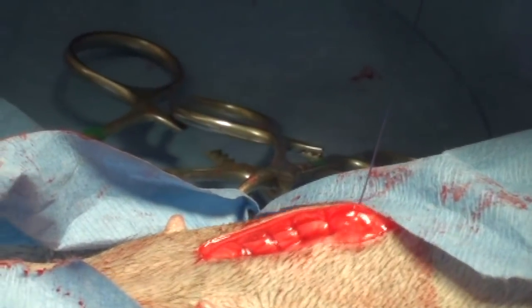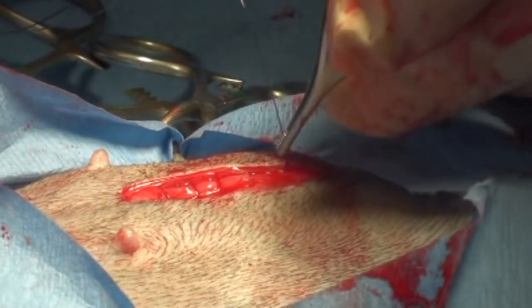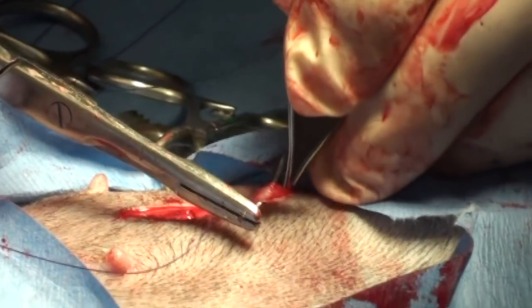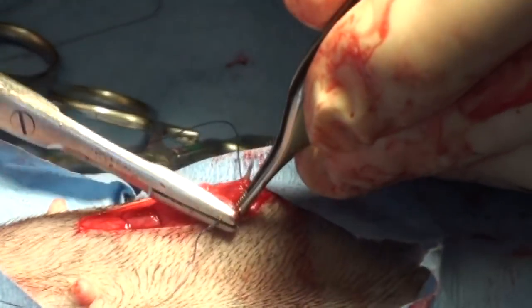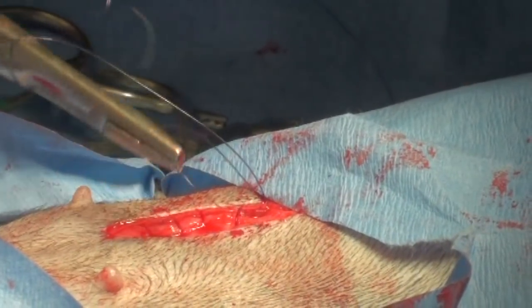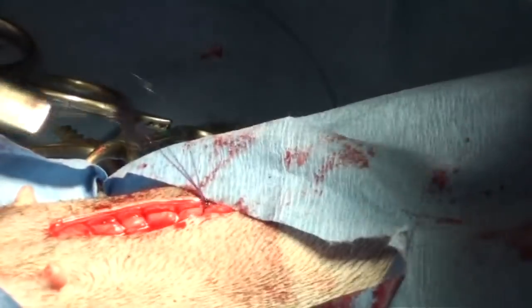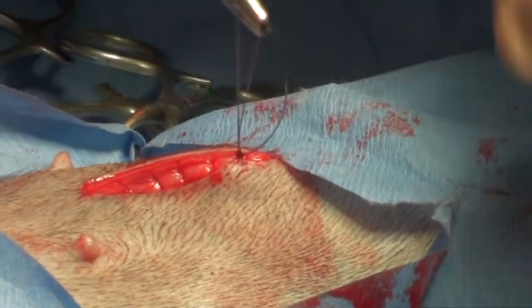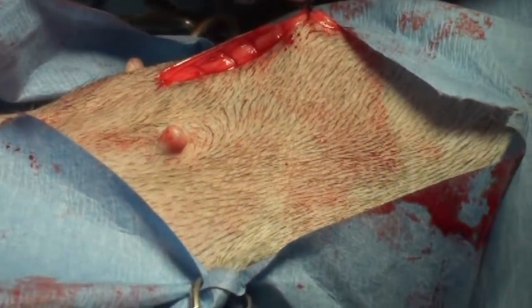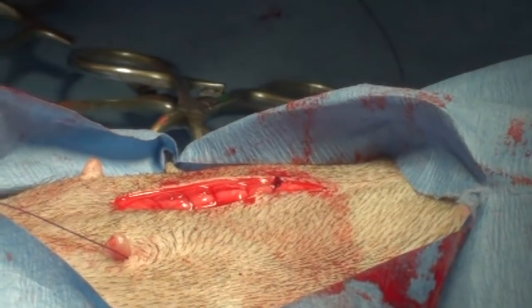See how nice that holds together — and then this will be the last suture. Now I'm going to tie a knot in it just like I did for the other sutures, and I don't make it too tight. That's the muscle layer, and there's the knot. Notice the incision's gotten a little smaller.